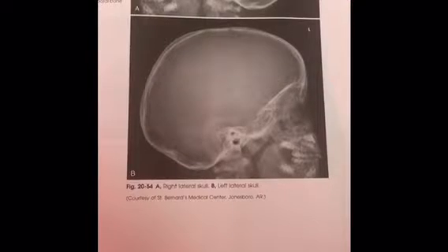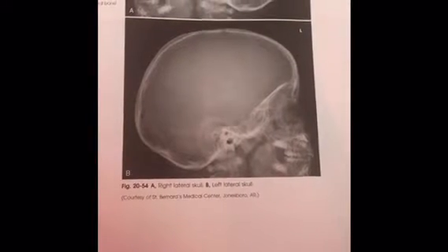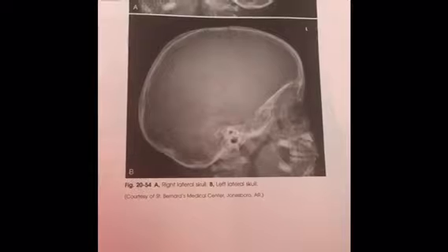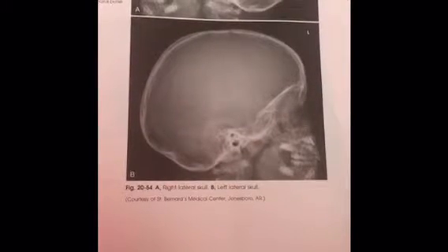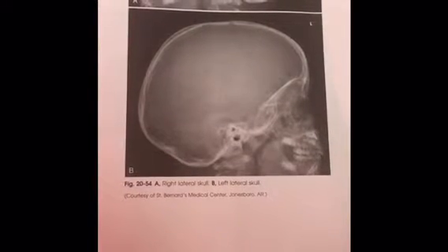Now that we are done shooting our 4 projections of the skull, we are ready to evaluate the images and make sure that they are of appropriate quality. This is our lateral projection of the skull, and the evaluation criteria is evidence of proper collimation, entire cranium without rotation or tilt demonstrated by superimposed orbital roofs and greater wings of the sphenoid, superimposed mastoid regions and EAM, superimposed TMJs, and sella turcica in profile, penetration of parietal region, and no overlap of the cervical spine by the mandible.